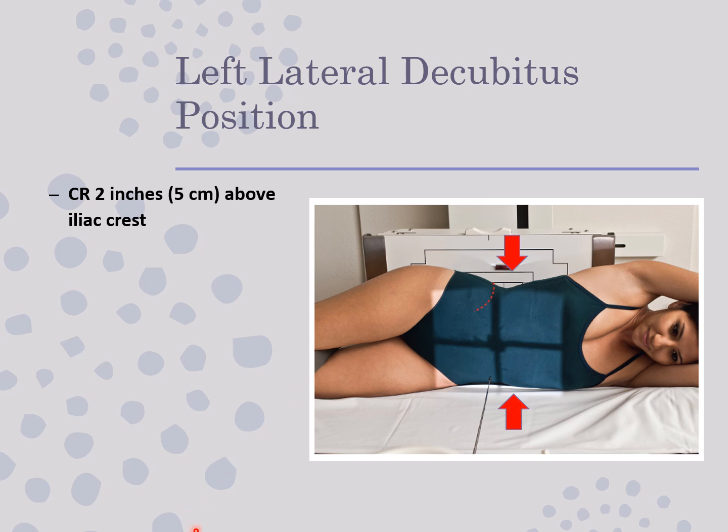And the exposure is taken on expiration, just like all abdomen. And in decubitus positions, they're called by the side down, but they're marked by the side up. So this would have a right marker placed on the top side of the patient, because that would be her right side. And then you could annotate an arrow or the word decube.